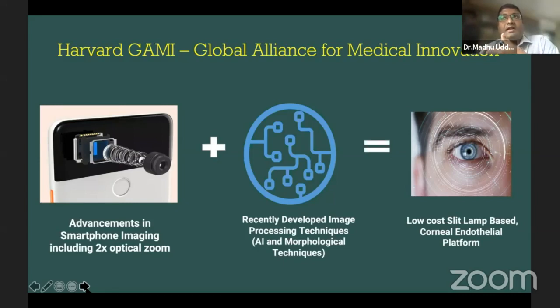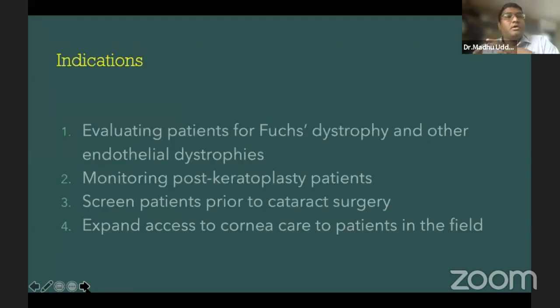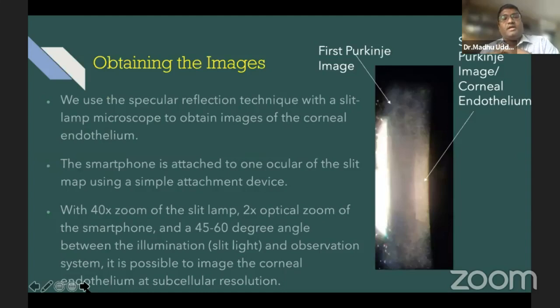And also added to it, we have added an analysis that is developed with the help of artificial intelligence and morphological technique. It's a combination of both. So this results in a low-cost slit lamp-based corneal endothelial imaging platform. So the indications are as it is for what I have done to the clinical microscope.